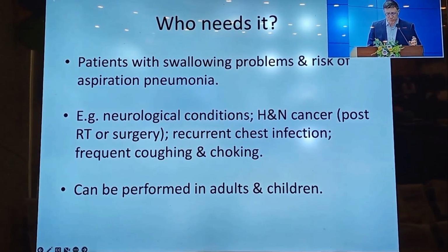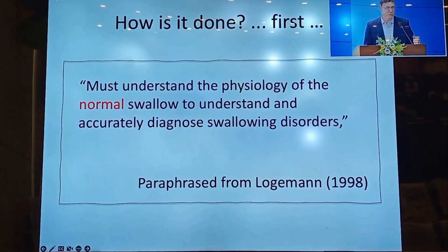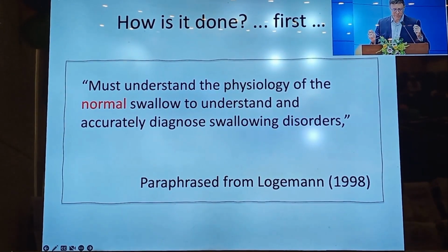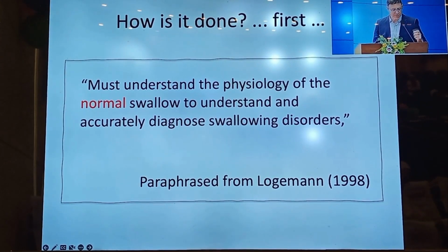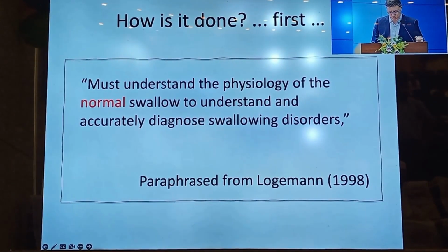Evaluation can be performed both in adults and in children. So how do we do the evaluation? First, we must understand the physiology of a normal swallow in order to understand and accurately diagnose a swallowing disorder.